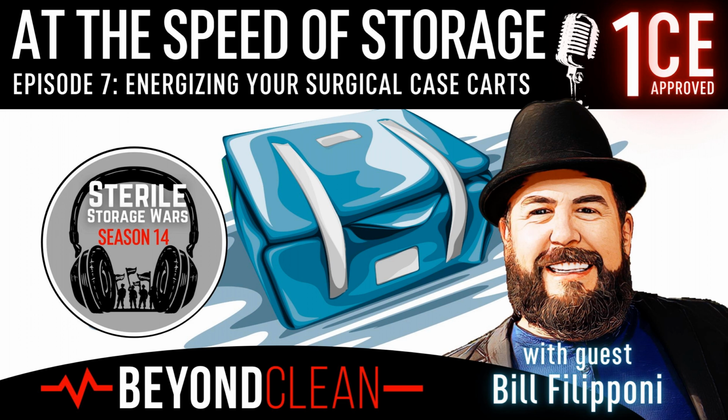Yep. So when you talk about case carts, there's a large division of what it could be, depending on the facility that you're working in. More or less, it encompasses all the supplies that are needed for a surgical procedure. You want that all to be available at the time the procedure starts, with everything they need in that container system. There could be closed carts or open carts. We'll get into that in a little bit.